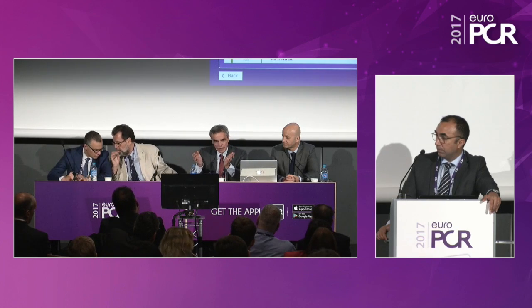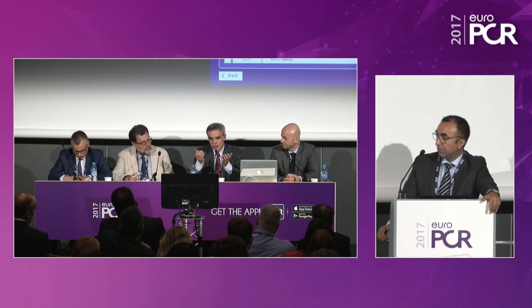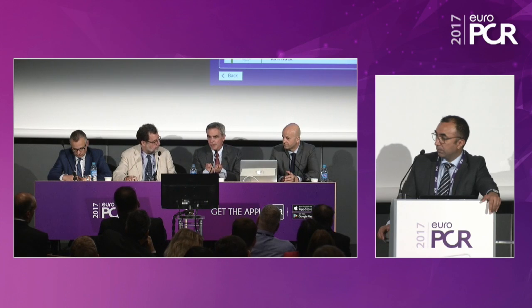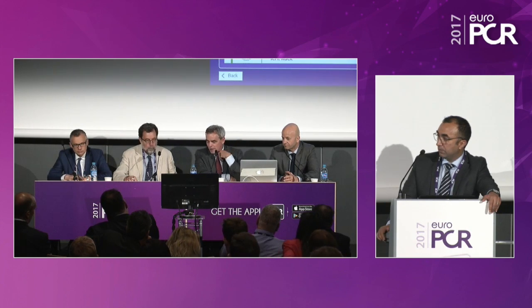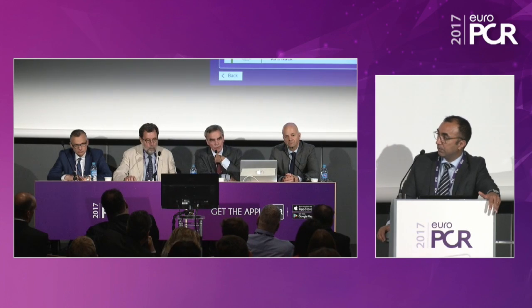If you look into the data analysis that the core lab Paul Graben has done, and if you look into the ischemic patient population, then something you can observe, what has been described by Dr. van Bardeleben, is that particularly the P3, P2 segment, which is mostly affected, moves more forward, and thereby is really compensating for the defect that was causing the mitral regurgitation. So you have some kind of an eccentric effect of the band, which is something you don't see if you have a stiff ring that you implant. So I think that this system really can adapt in some way to the individual anatomy of a patient, which probably gives you the better effect beyond what has been described already in comparison to surgery.